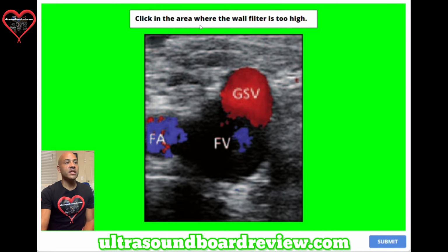Question 5. Click in the area where the wall filter is too high. The answer will be anywhere where it's anechoic.